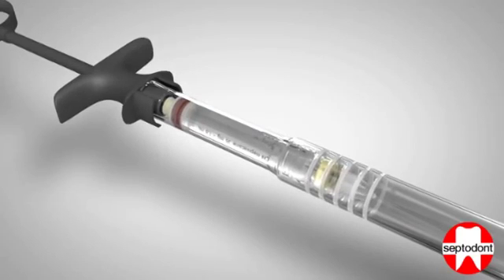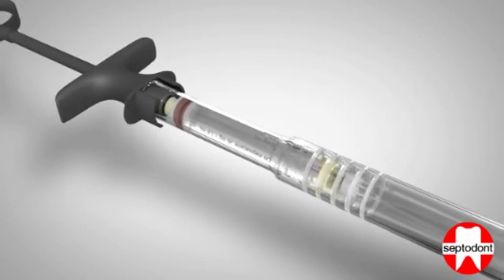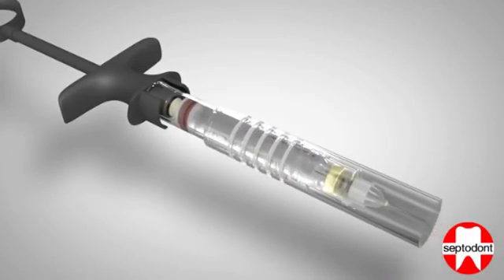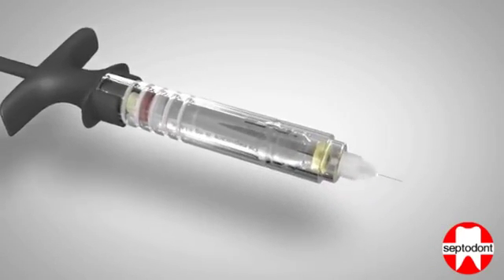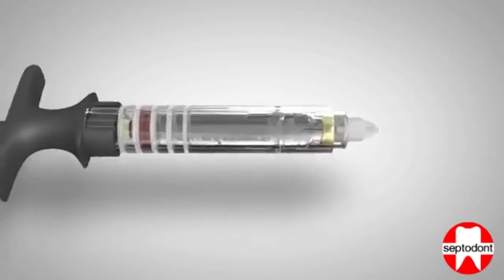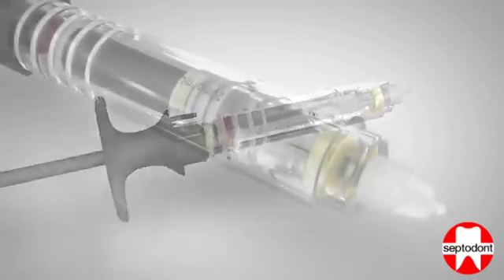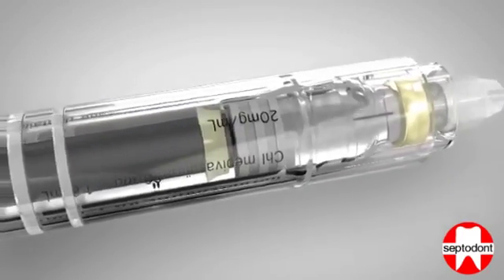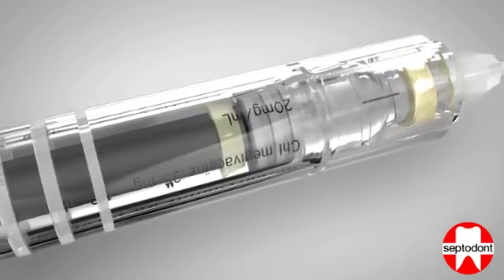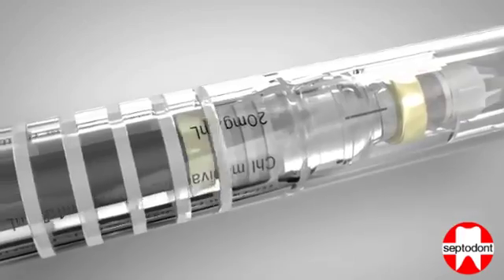When the device is required to complete the injection procedure, carefully slide the protective sheath back to expose the needle, as in Step 3, and continue the injection procedure. After you have finished the injection, remove the fingers from the handle and grip the finger holder.